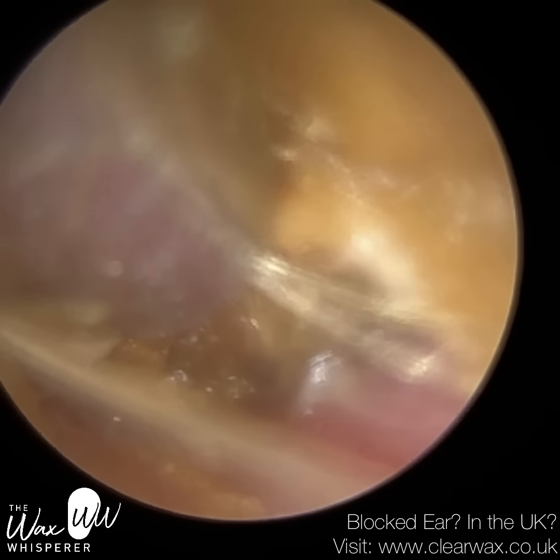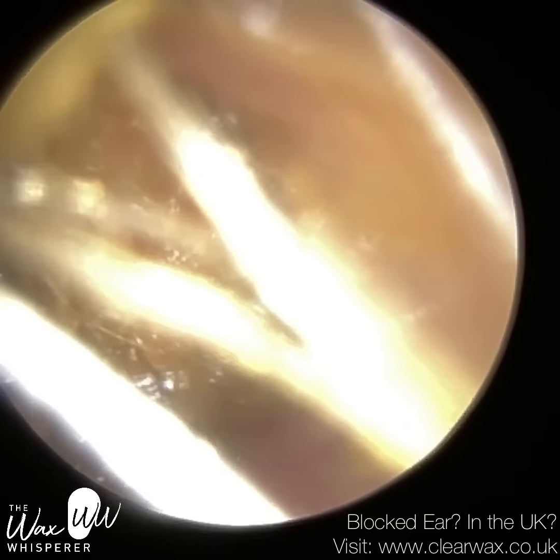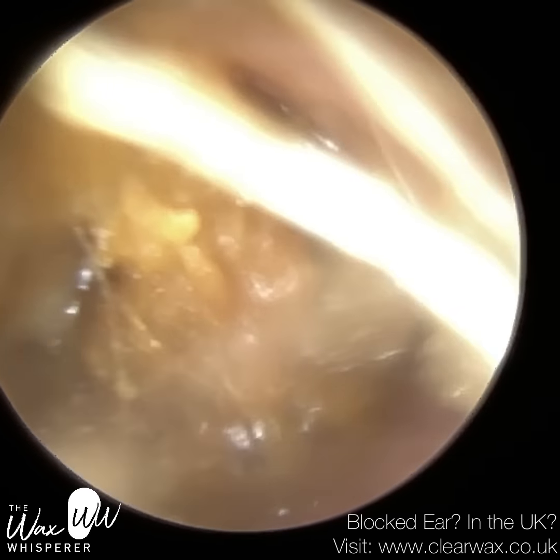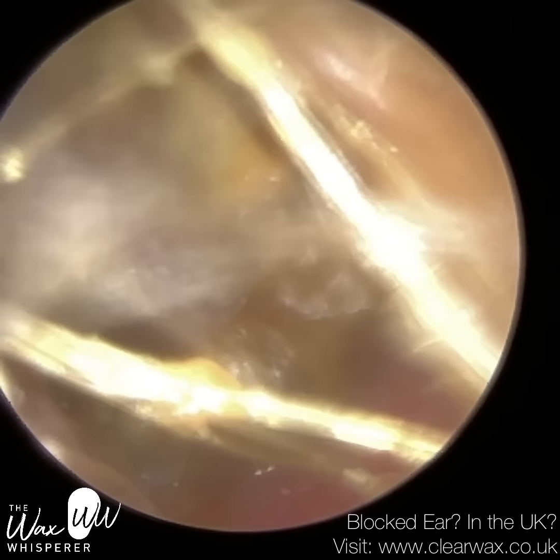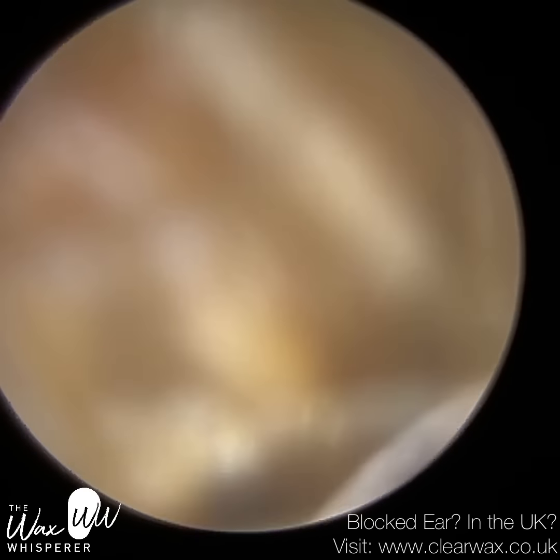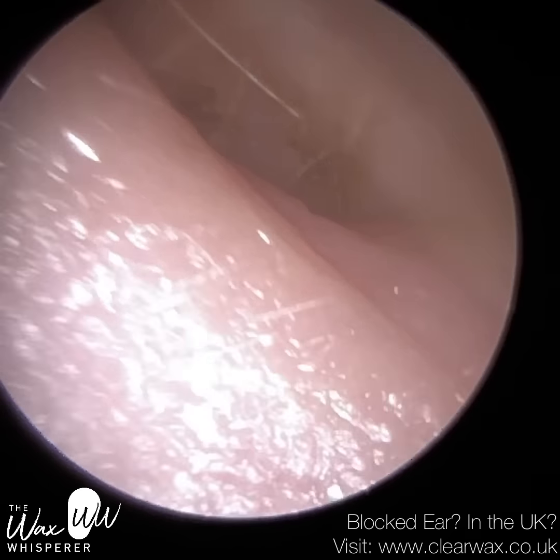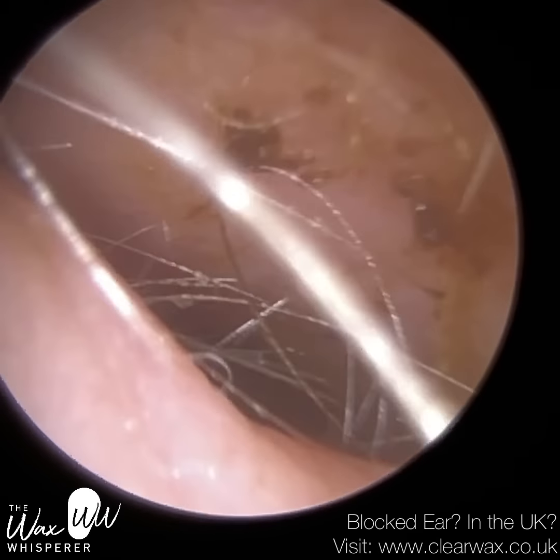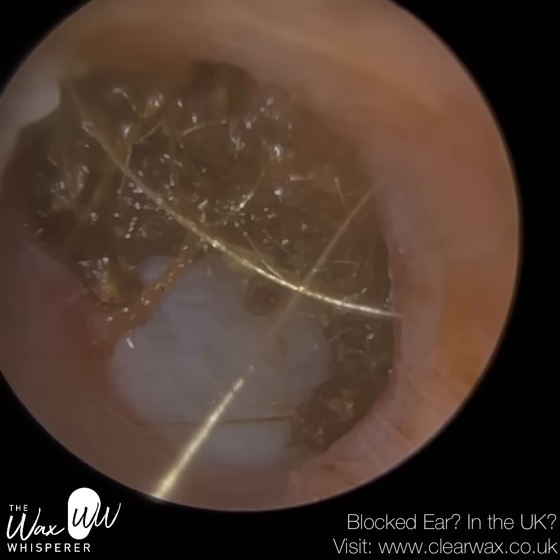Under those circumstances, if the collapsed ear canal is causing significant issues — for example, it's completely obliterating the entrance so no sound can travel through, causing significant hearing loss, or the patient is developing chronic ear infections — an ENT surgeon can perform a meatoplasty, where they trim some of the cartilage away and widen the ear canal. I've managed to remove a large plug of wax there, and I wouldn't have been able to do that without the olive oil spray, which worked a treat.